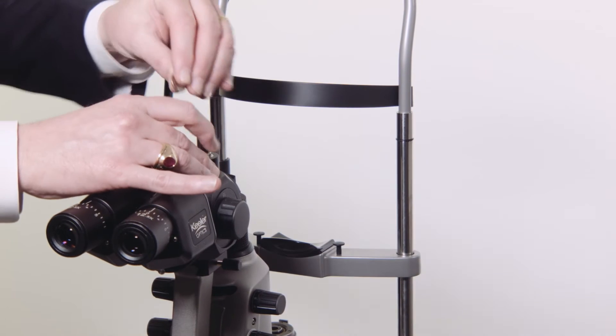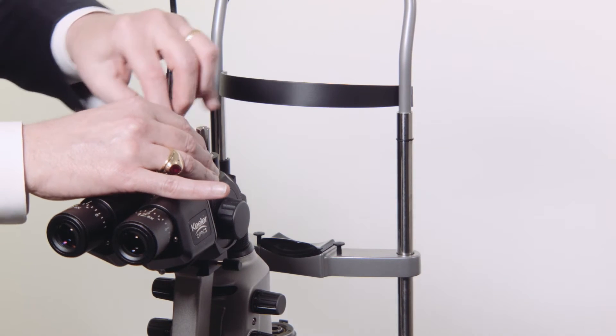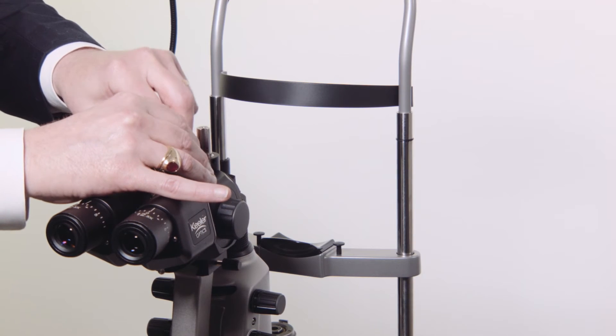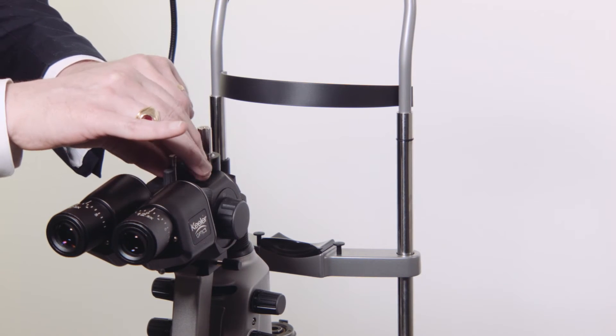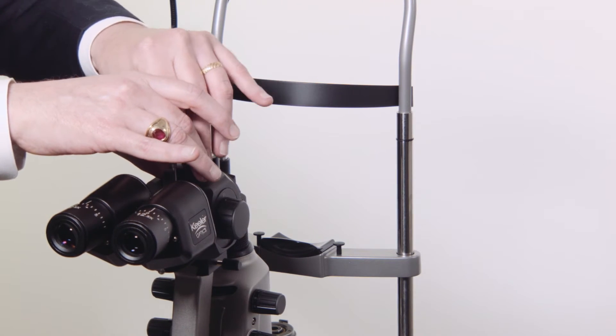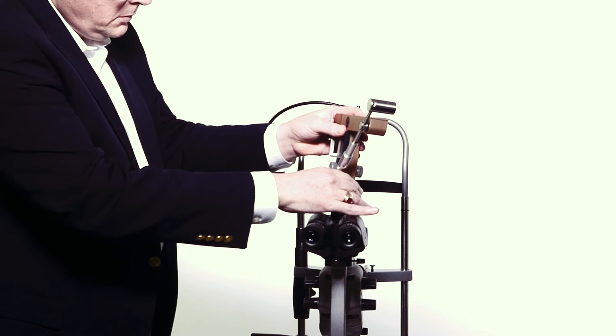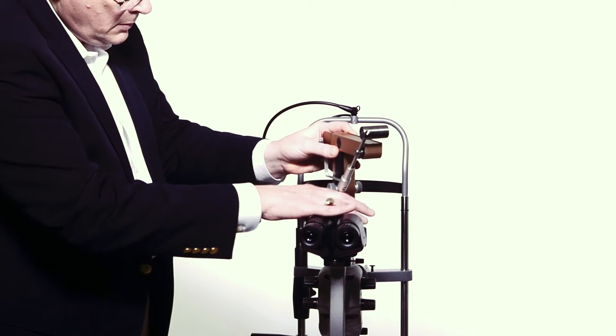To install the Z-type tonometer, which is specifically designed for ZEISS-style slit lamps, mount the plate onto the microscope body using the securing screws. Mount the tonometer onto the mounting post.